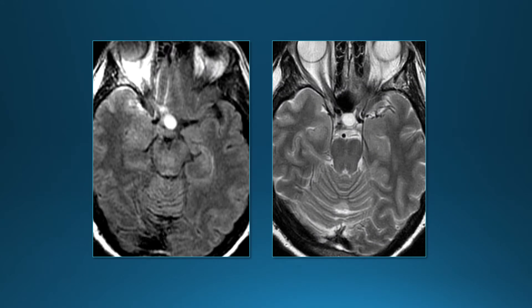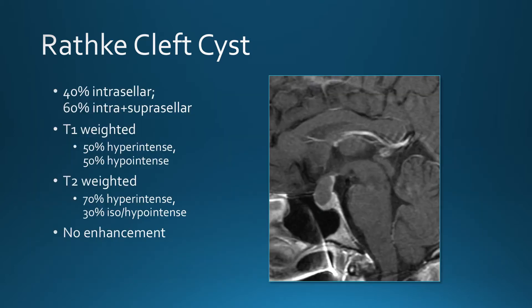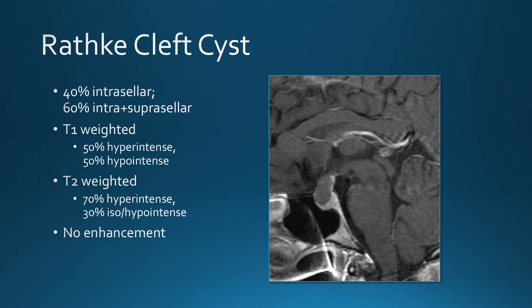Suprasellar mass, bright on FLAIR and bright on T2. On pre-contrast T1 it's iso-intense to brain, maybe slightly hyper, with no enhancement with contrast. It involves both the sellar and suprasellar region — this is a Rathke cleft cyst. These can be just intrasellar or combined intra- and suprasellar. On T1, half the time they're bright, half the time dark. On T2 the majority are bright but occasionally iso- or hypo-intense, depending on protein content, with no enhancement.